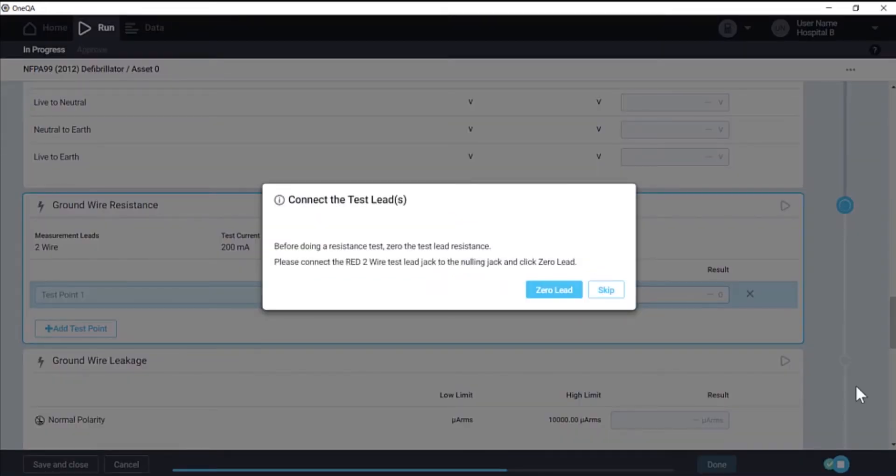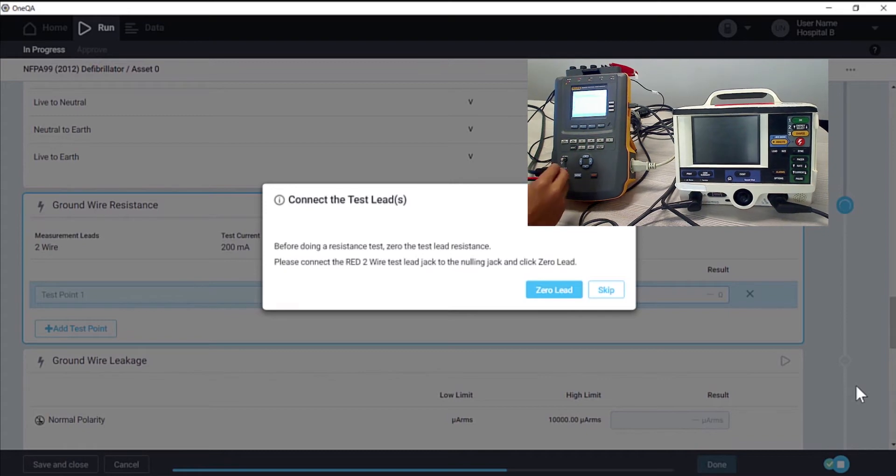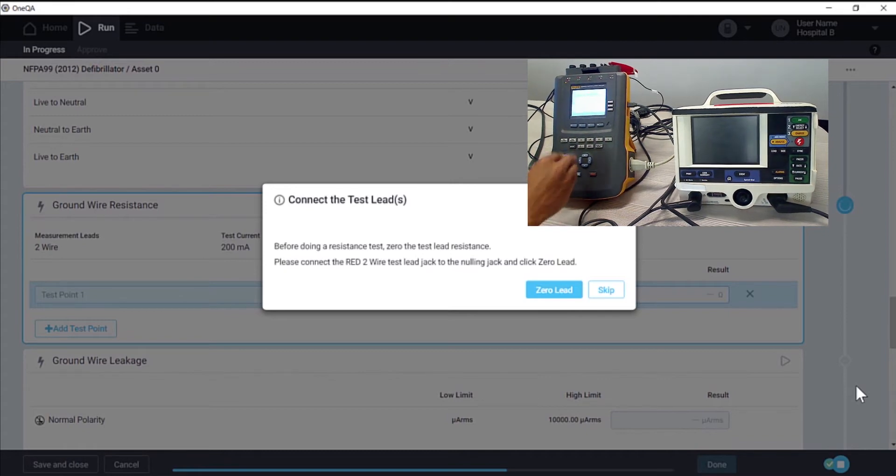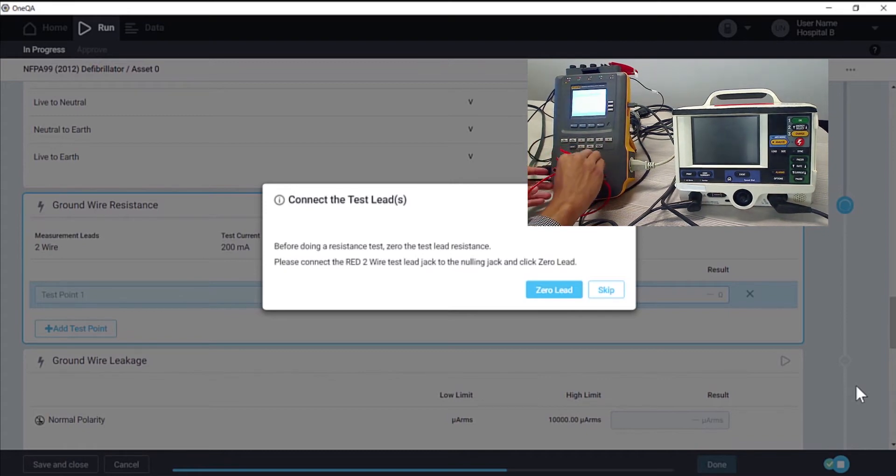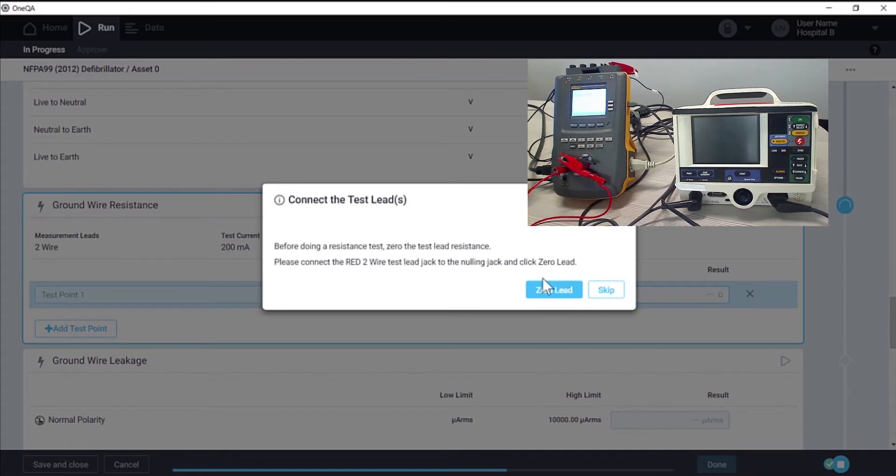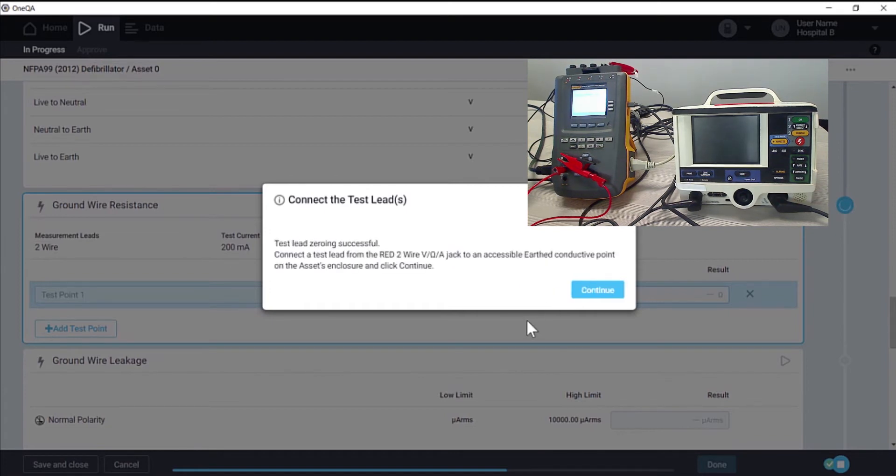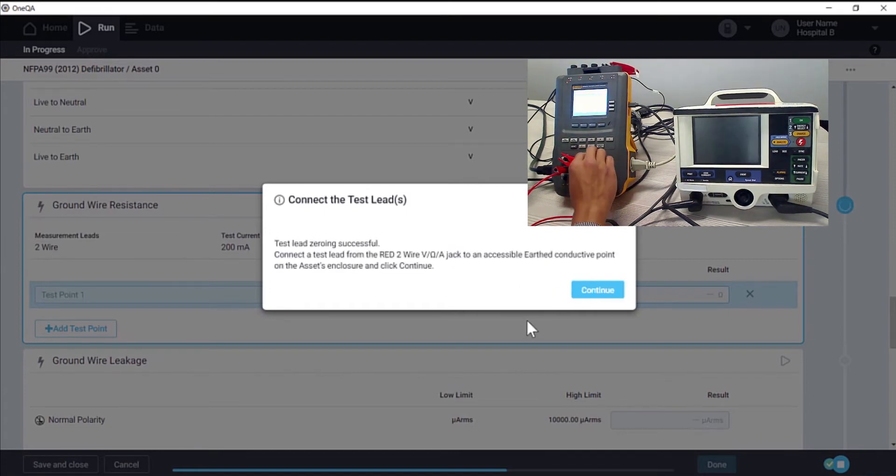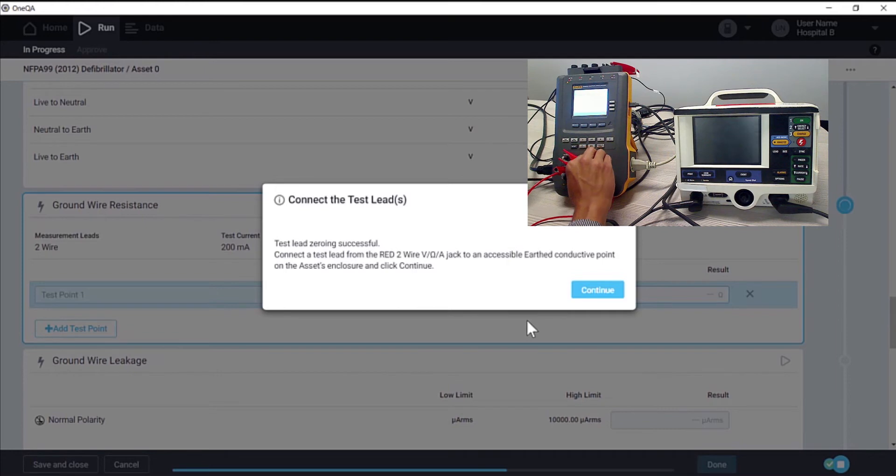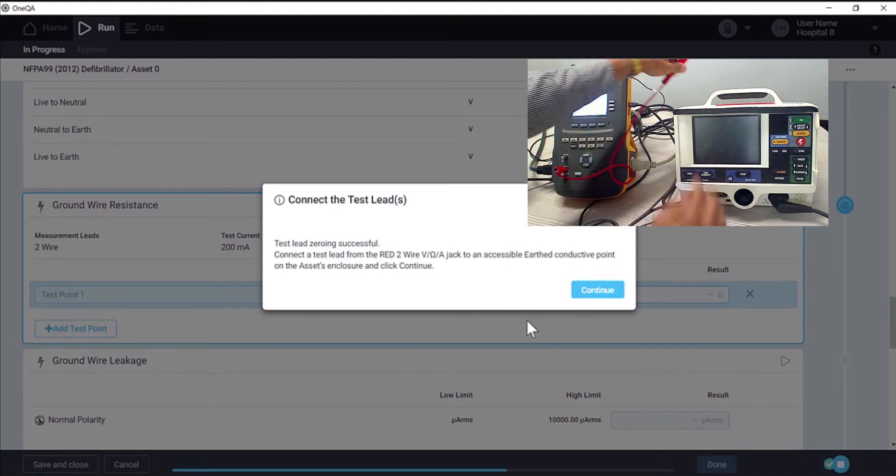During test execution, there will be dialogs that instruct you on lead connections or reconnections. In this step, we need to zero the test lead before we take a measurement. Once it's zeroed, we reconnect the test lead to the asset.